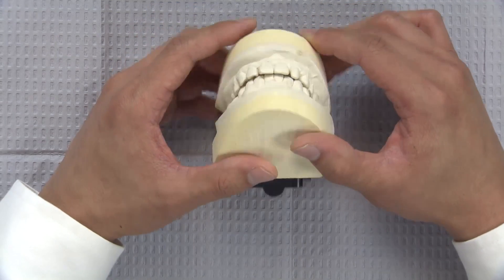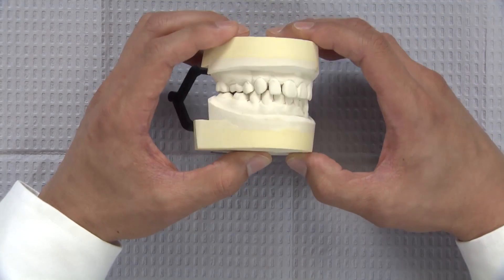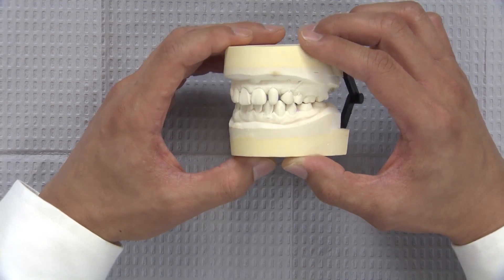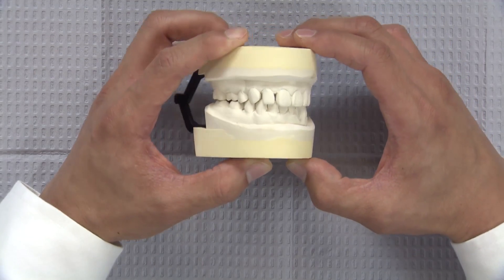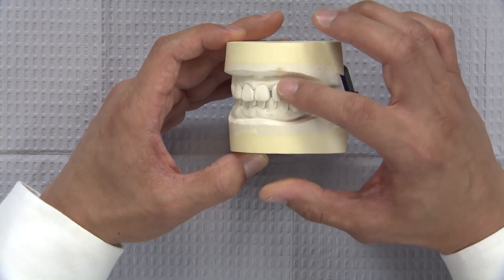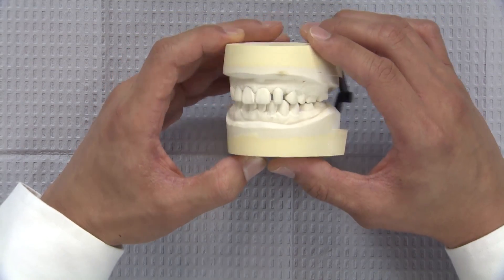We certainly have many different options today in dentistry. I will attempt to do this using the most minimally invasive method by applying composite bonding to the mesial and distal surfaces of the laterals.